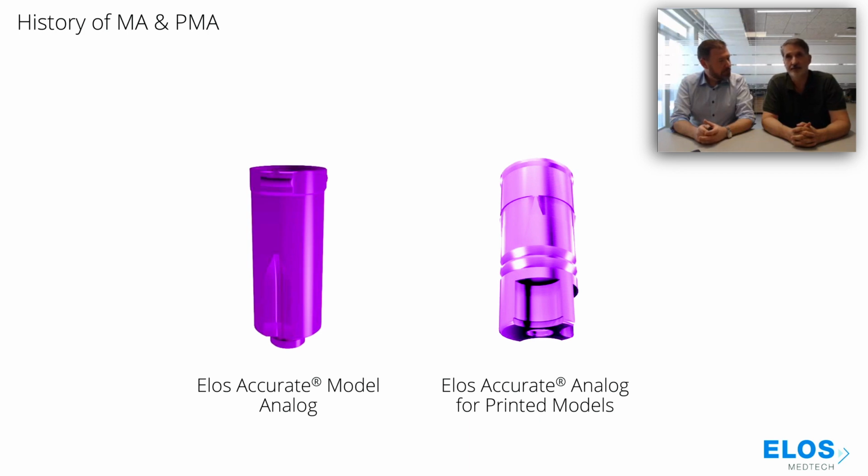Right. And maybe you remember, and I remember as a dental technician, that in the beginning you didn't have the possibility of in-house printing. You sent it to big service centers that worked with industrial 3D printers, which were very expensive, but it's easy to control the process, because you just had three or four resources to print worldwide. In the beginning of this emerging technology, it was more accurate for the first years, because you had bigger industrial machines, more control and all that.